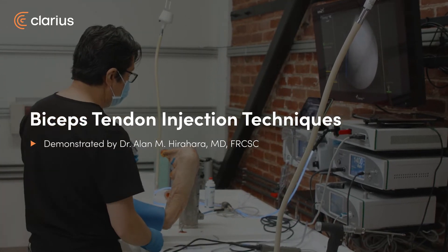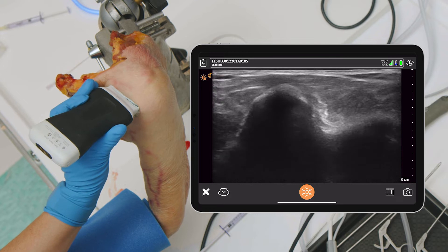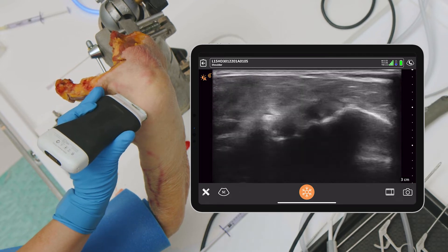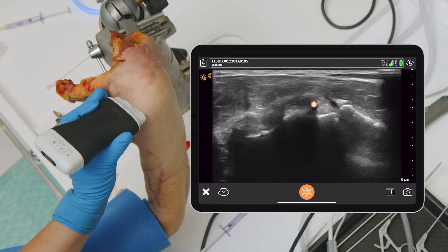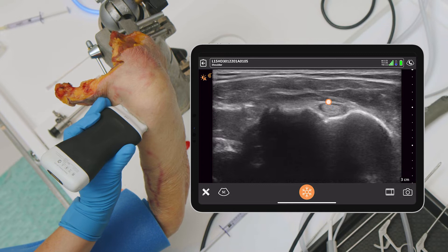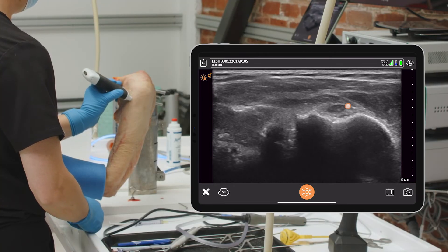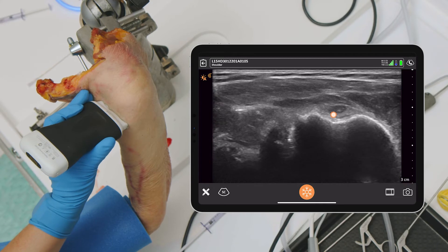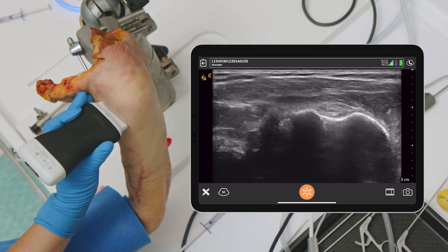We're going to start off with just doing some basic scanning, and I'm going to be showing just the biceps tendon because we're going to be working on that surgically pretty soon. So we're just going to identify the biceps in there. You can see it pretty clearly right there and we're going to follow down into the groove. You can see it nicely, and of course you can see that issue of anisotropy. So if I tilt it this way it becomes black, which means you can't really see the tendon, but then as I tilt it down there's the tendon very nicely there.